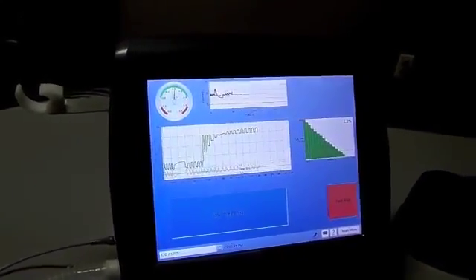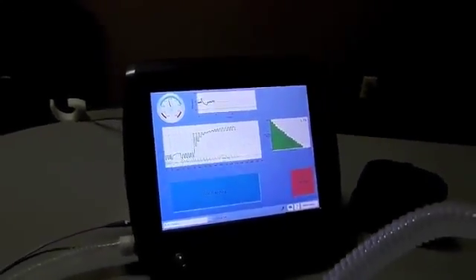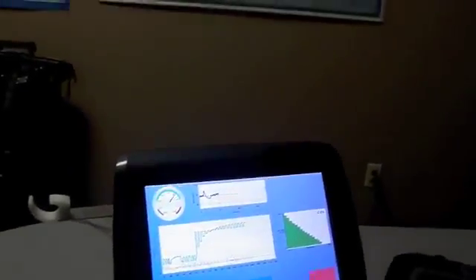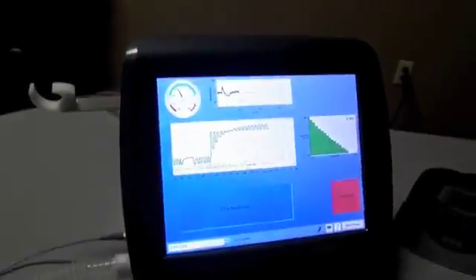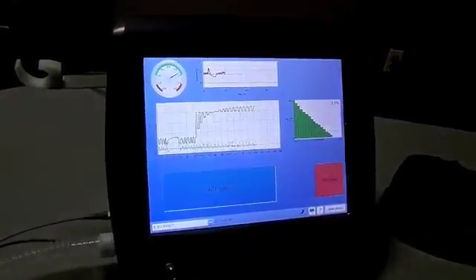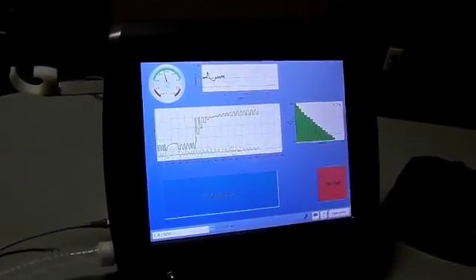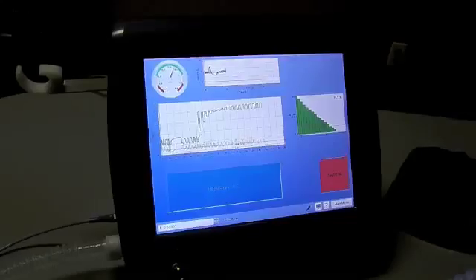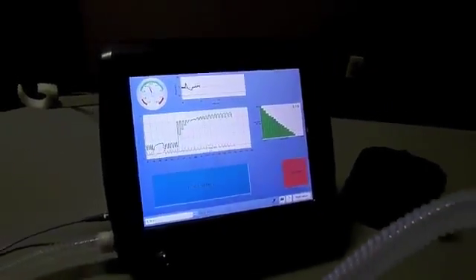So now she's below the 2%. Now she has to achieve so many, and the machine will automatically stop. Or if you wish you can end the test manually. We'll let it automatically stop.